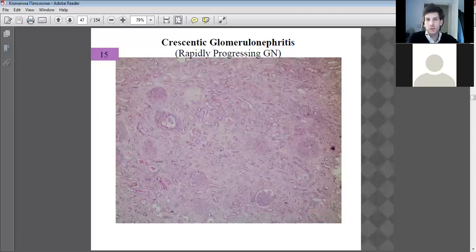And notice the loss generally throughout the tissue of your tubular structures. You've got some still remaining. This one is still there, fairly normal, but big spaces, loss of them. These are degenerating. Got some blood vessels there, but generally you're getting some spaces forming in the renal tissue, which is abnormal, lumens forming, breakdown of the tissue.